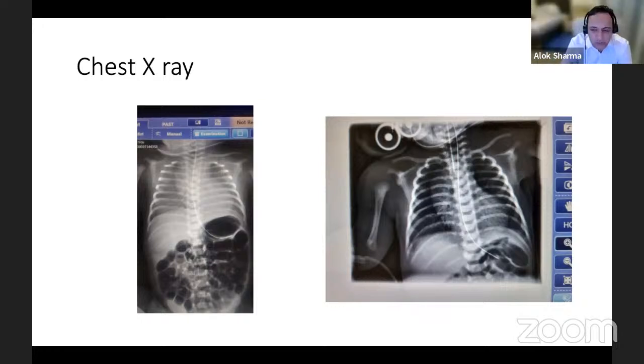Just one last question, Dr. Zahreddin. Clinically, in terms of infection, culture is negative, CRP is normal? Absolutely, yes. The baby had a normal CRP all the way through. The blood cultures were negative. I started him on antibiotics. In our part of the world, we wouldn't risk it. But again, a very nice ultrasound to demonstrate subpleural consolidations and what is quite a severe presentation of RDS with a good response to surfactant. So, my compliments. Thank you so much.